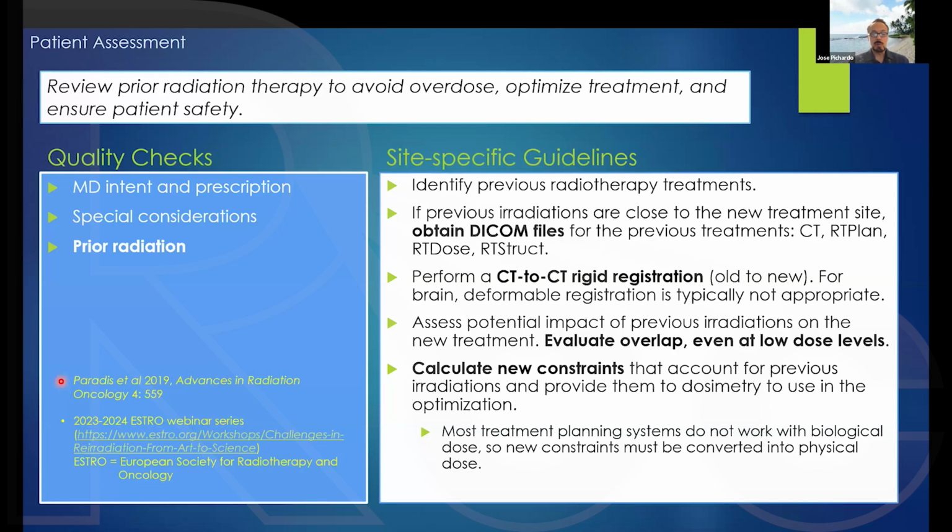I can tell you when I've worked with different physicians, some physicians feel comfortable using the dose discounts that are indicated in this paper, and some physicians are not. So in those cases, you just assume that the dose was given recently. But it's reasonable when you think about it. It's reasonable that some repair has taken place from the time that the patient was treated to the time in which you have to give the patient a new treatment. So if you consider the full dose, you're always overestimating what that organ received.